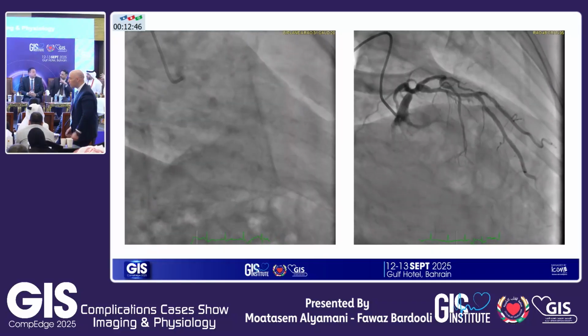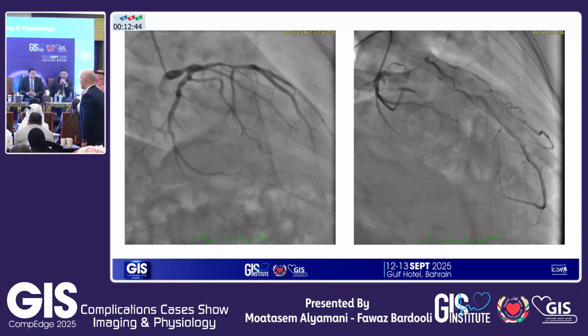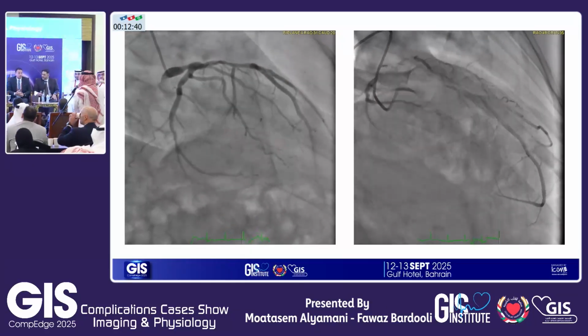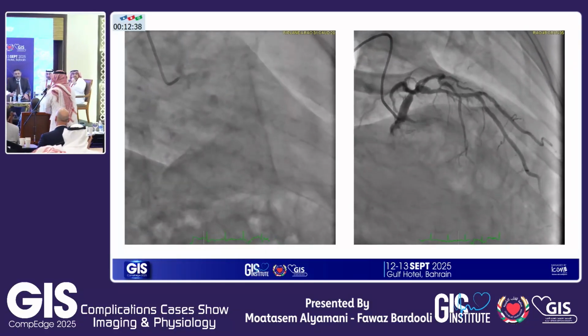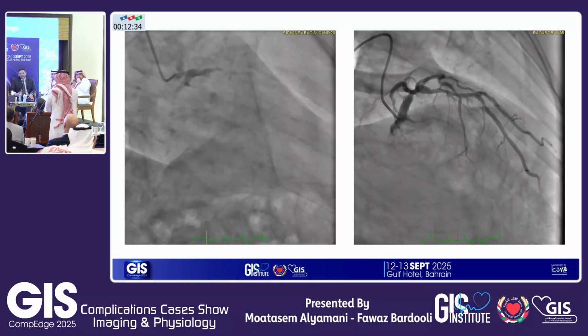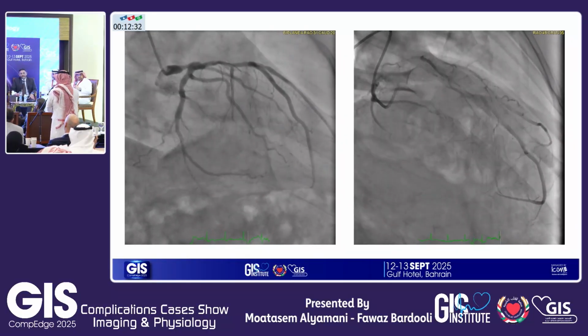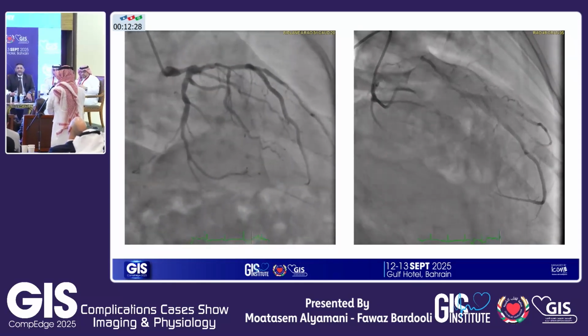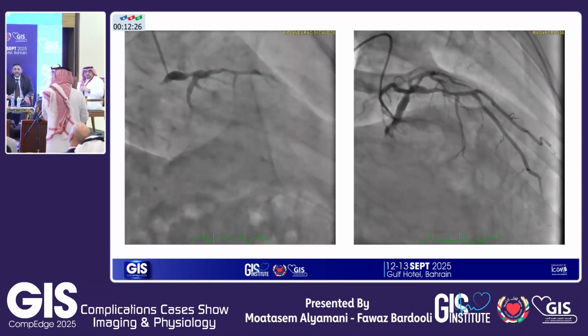Now, the debate is from left main intermediate to revascularize to imaging versus physiology. Let's hear Hamid then. I think for a quick and practical approach, if you're not convinced that it's a surgical case for the heart team, then get peer review in the cath lab. Because I think we all work in the cath lab, you can just get a pair of eyes to get you another opinion.